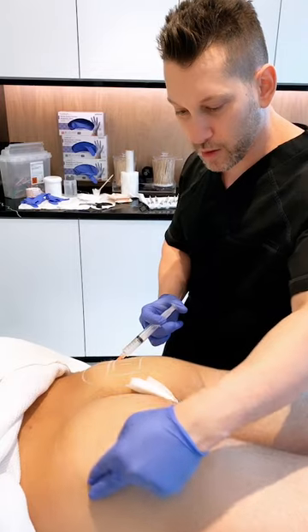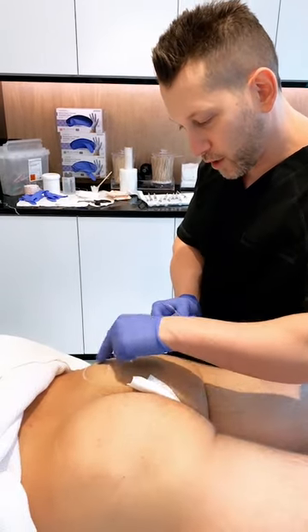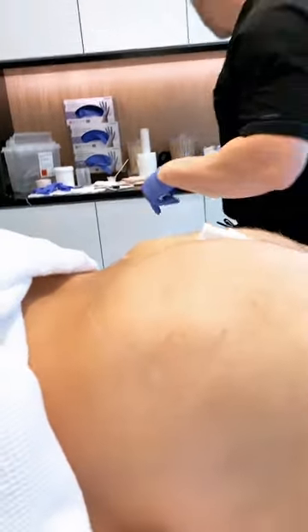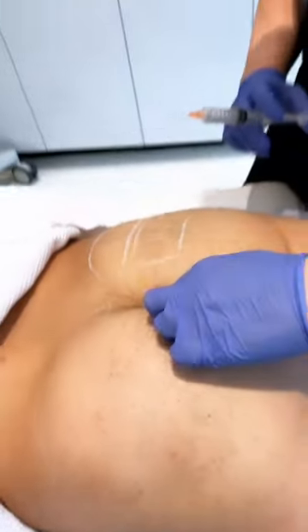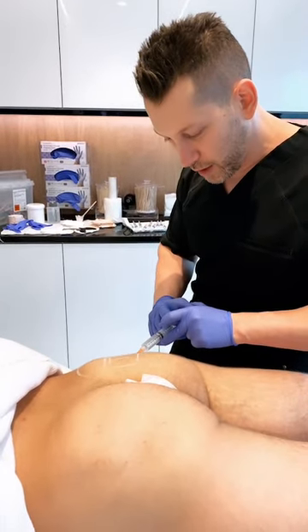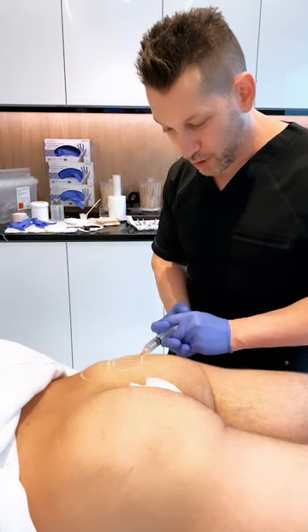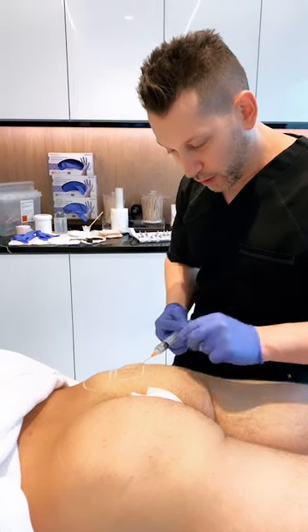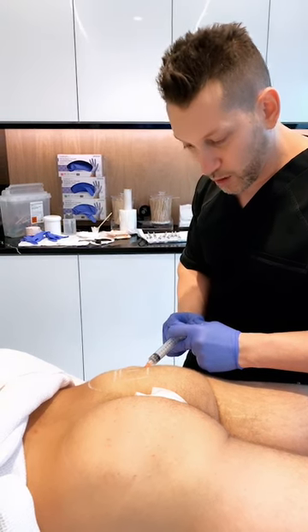My goal for him right now is to give him more of this upper portion. You see how on this side we've now lifted it here in the upper pole. Take a look at the upper pole of the buttock. The thing is, if you do too little, you just won't see a result. Meaning that there's collagen in there that's working. So we're getting a really good improvement, but we're just going to keep doing that.